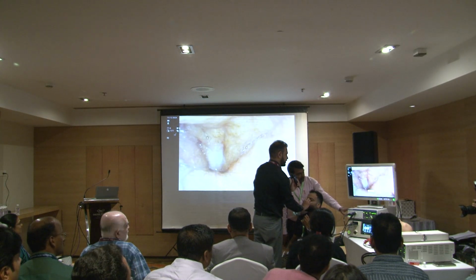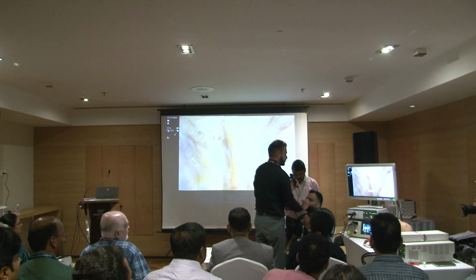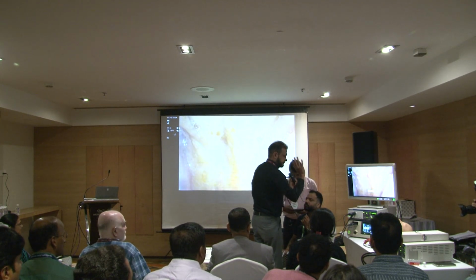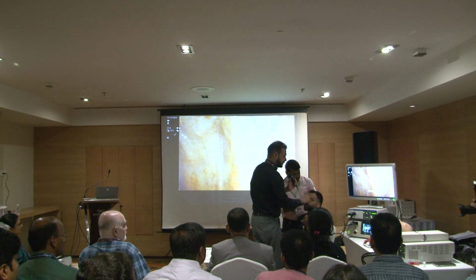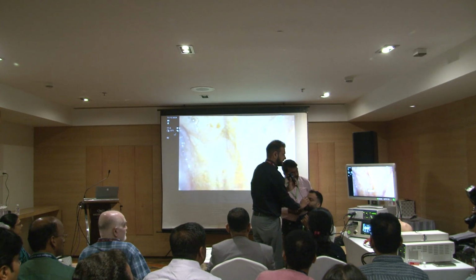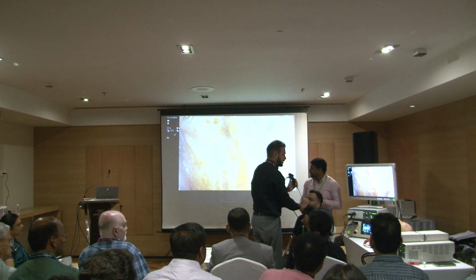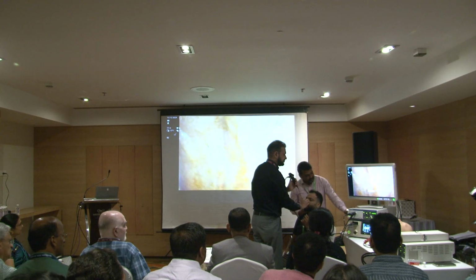At this stage, we tell the patient to close the mouth and breathe from the nose. Now this was a phase where he was not comfortable as we pass something through the nose. Now his comfort level will be more, but at this stage, wait for a few seconds. Let the patient understand what has happened. And now he has to breathe from the nose because we want to see the palatal movement.